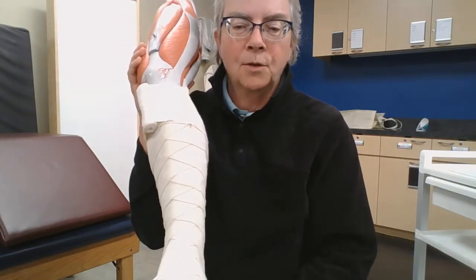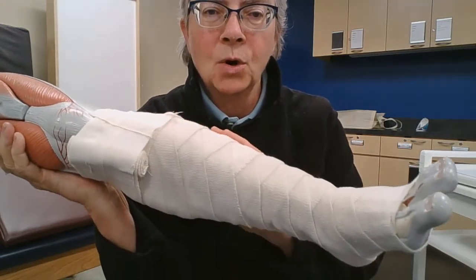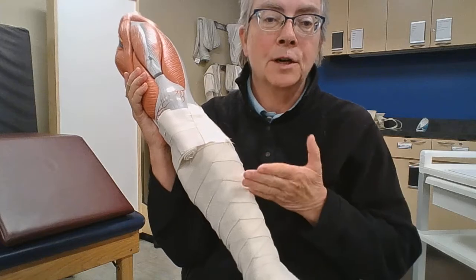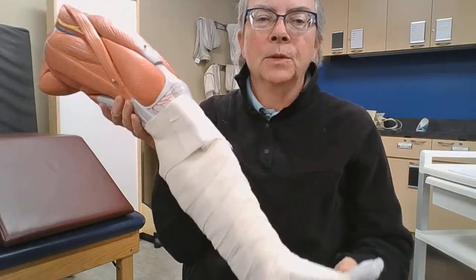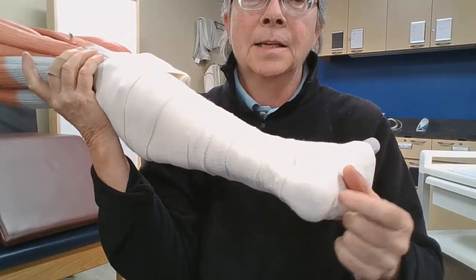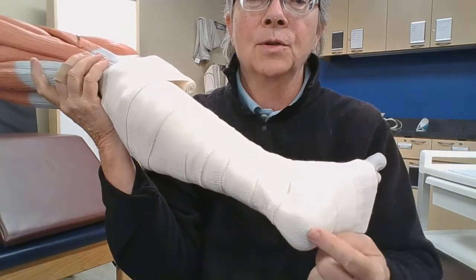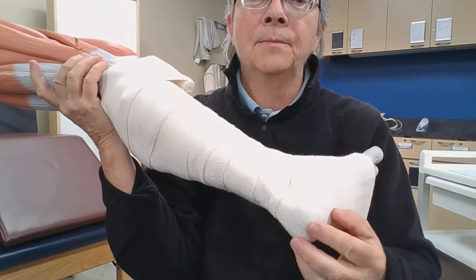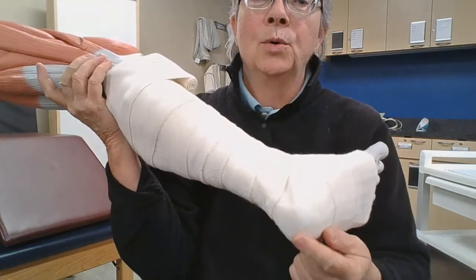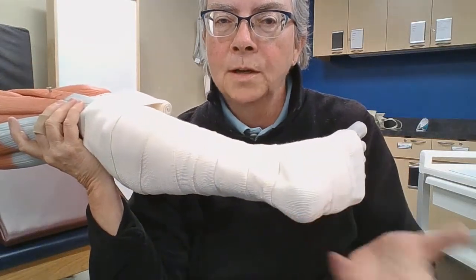And the other ones are there are no wrinkles. You can see here, there are no wrinkles or gaps. What a wrinkle can do is create friction in that area. What a gap will do, and often you guys, this is where you don't check as you're going up, is at the heel, you want to get through that ankle too quickly, and there's often a gap here where there's no ACE wrap covering the heel. So always, always, always, before you start going all the way up, make sure that you have covered the heel completely.